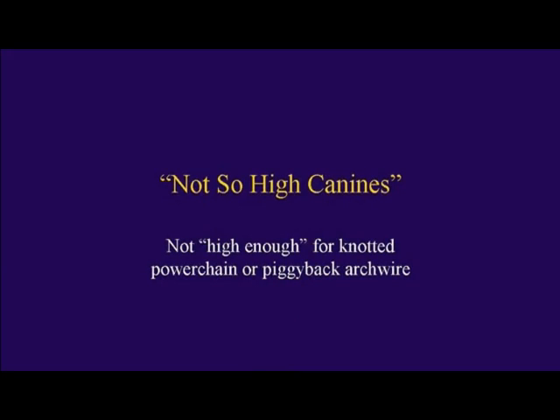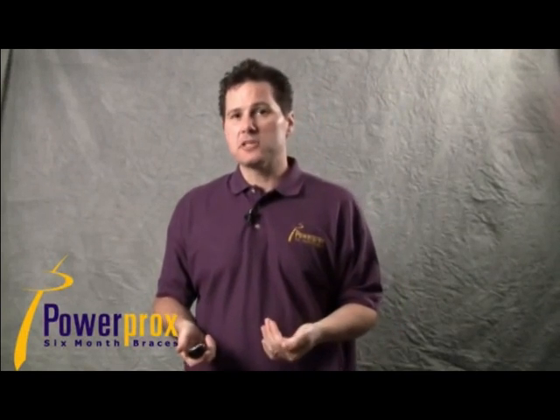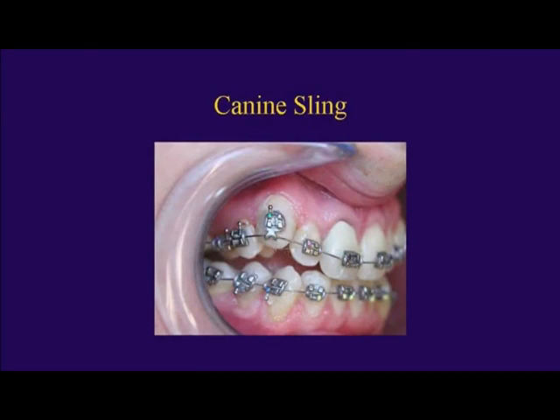Now, what if you have what I call a not-so-high canine? A canine that's not quite high enough for a knotted power chain or a piggyback arch wire. Here's a neat little trick in those situations. It's what I call the canine sling. The canine's still too high for me to want to go up after it with continuous arch wire. But if I put a knotted power chain on it, you're only going to have maybe one loop of chain and nothing's really going to happen.